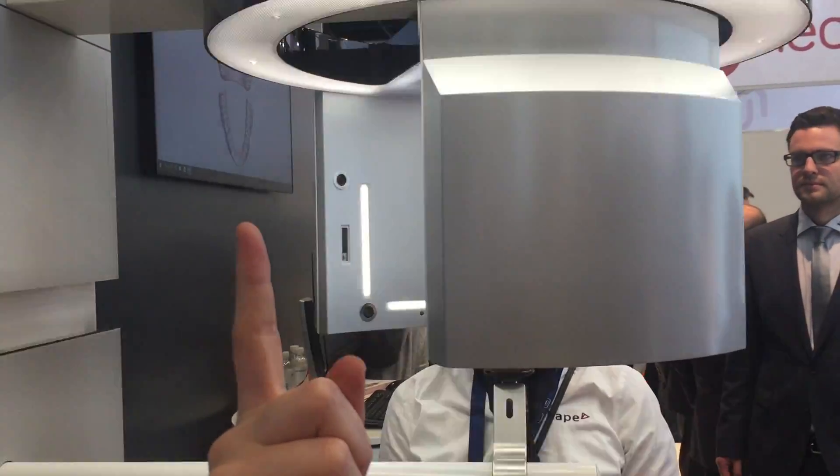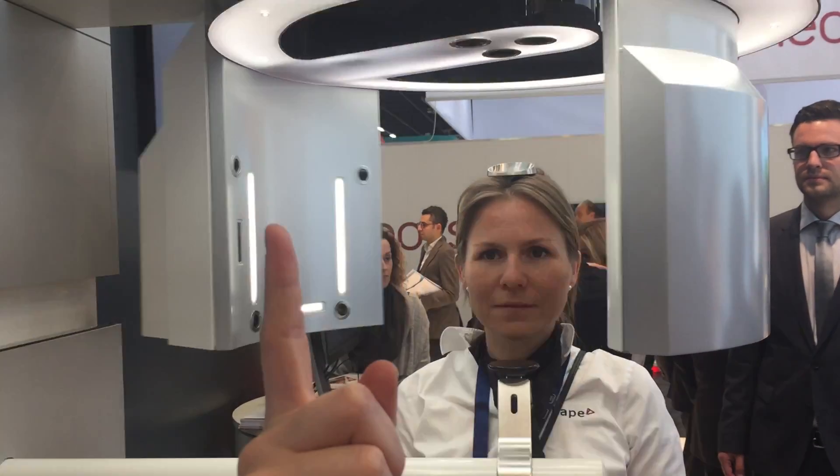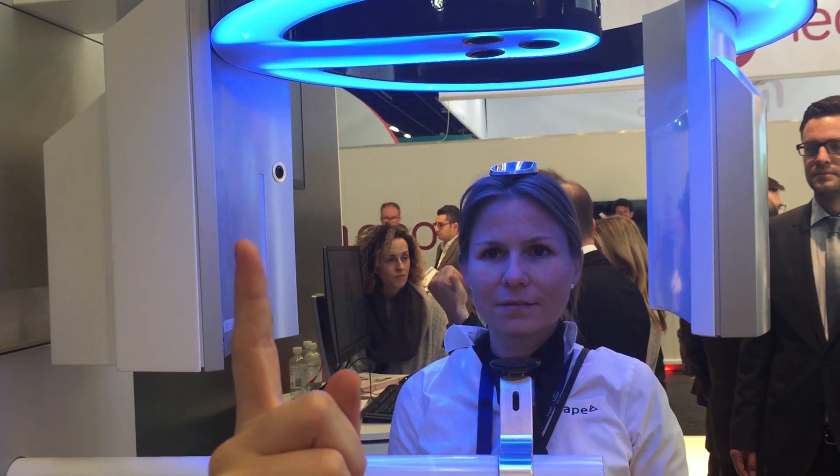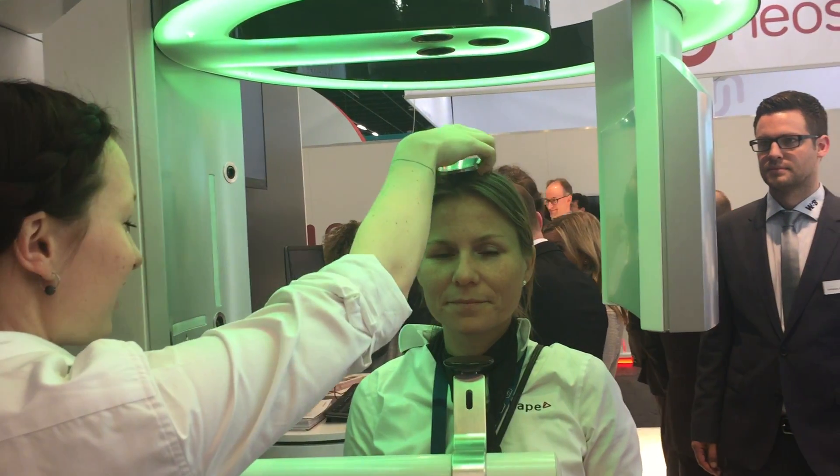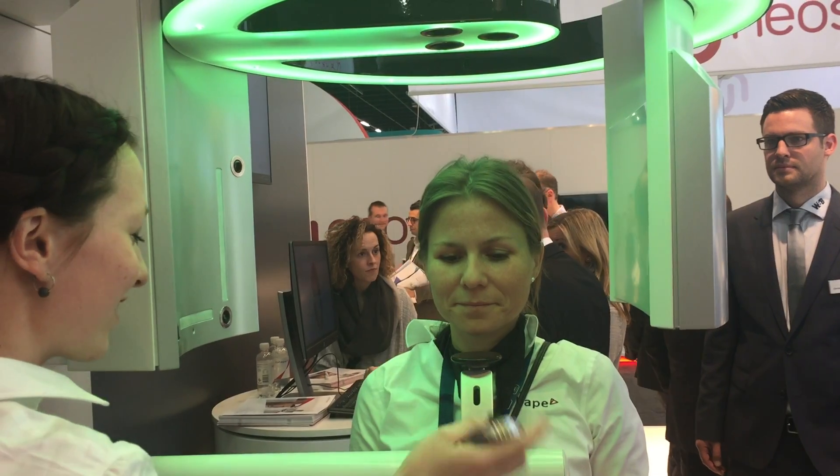I told you that we come with some good stuff. We always keep our promises. Now we see if we keep those.